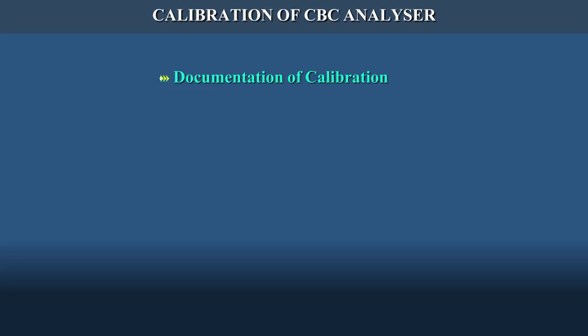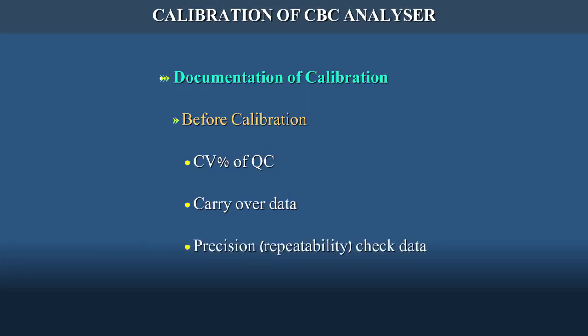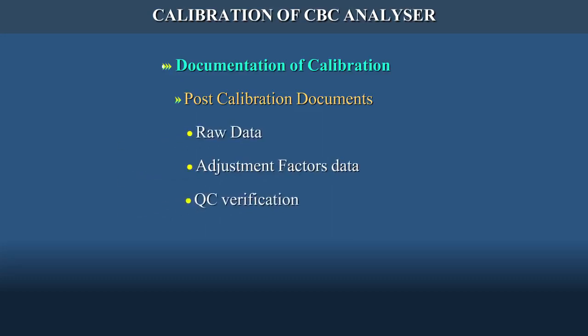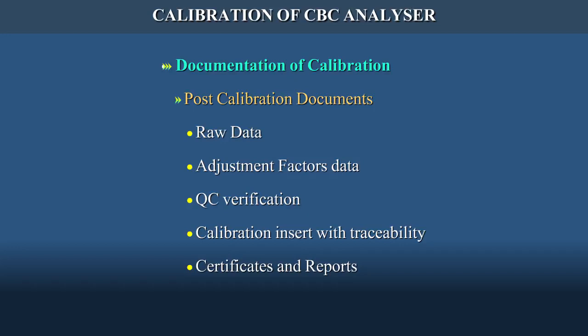Documentation of calibration. Before calibration: CV% of QC, carryover data, precision repeatability check data, background check. Post-calibration documents: raw data, adjustment factors data, QC verification, calibration insert with traceability, certificates and reports, factor change documentation.